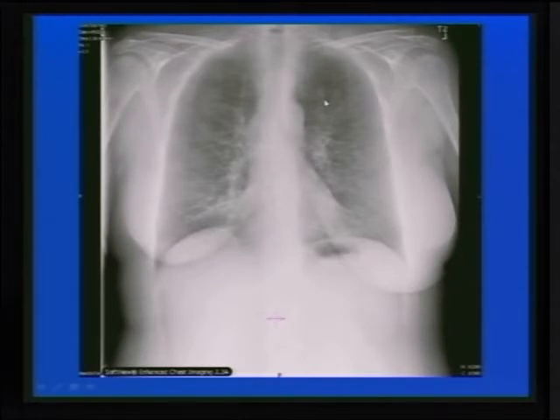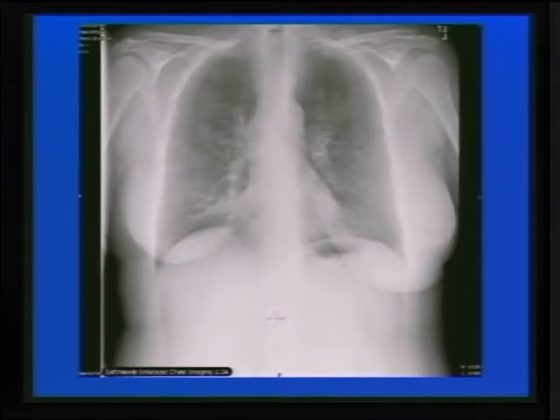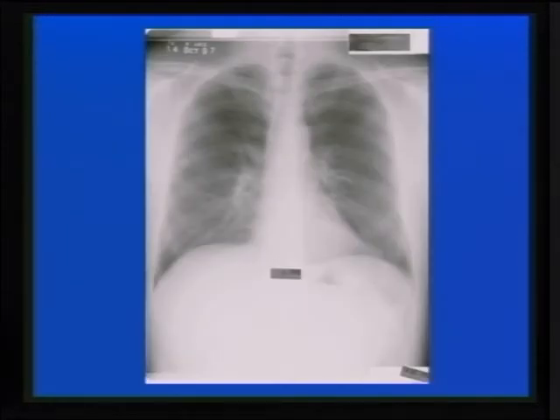Left upper lobe. Again, let me go back. And this is an actual case. This is actually the first day of my case, and I have to say that I read this X-ray and I missed the lesion. Applied this post-processing, 2 seconds later, and here it is. How about here?